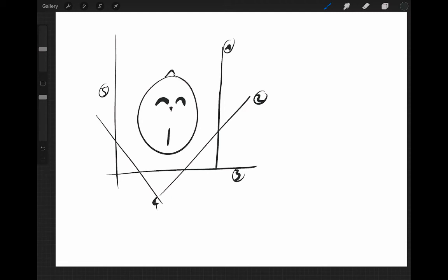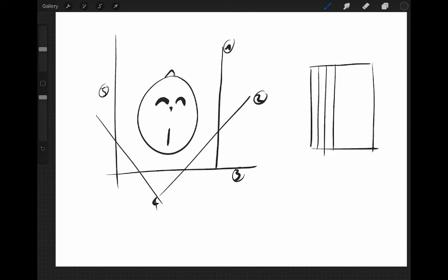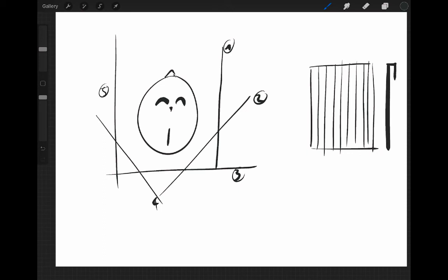So for starters, what I want you to think about is, if this is an image, then we're actually talking about a cube of data, or a slice of data if we're just thinking about a slice in 2D. How, in MATLAB, could you get the maximum intensity projection, which would just be a line here, or a line there, if this is just a table of numbers, a matrix of numbers? What's the operation that you'd have to do in MATLAB to achieve that? Okay, so that's the first thing I want you to think about.